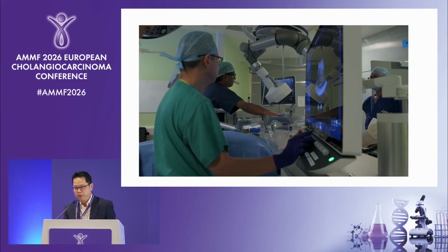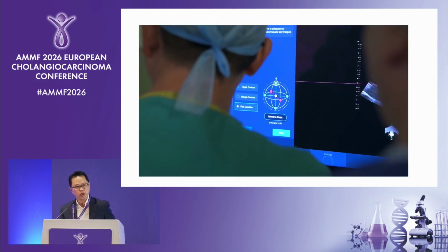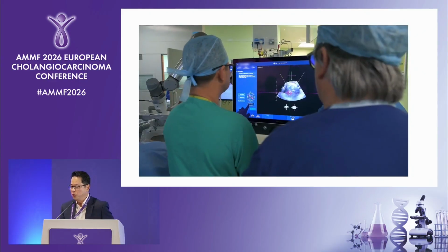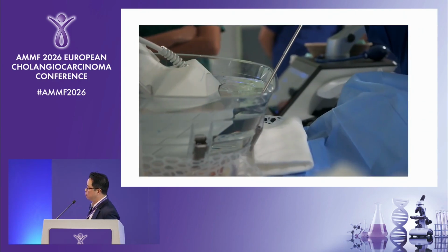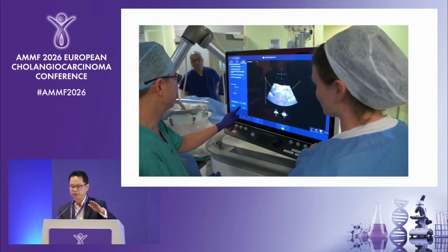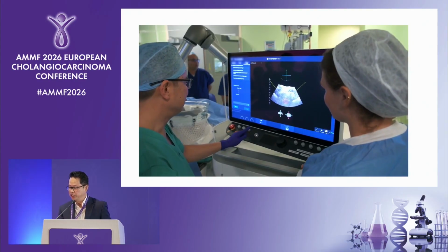So you continue. The important point here is targeting, that you are able to target the tumor accordingly. The most difficult part of the procedure is actually localization, or targeting the area precisely that you want to do. So we will have to spend a little bit of time, and once you're happy with that, then you contour the system, like identify the areas that you want to control. And therefore, the patient needs to be asleep, because if they move with respiratory excursion, then whatever you contour here may be misplaced, and you will not be able to deliver the energy accordingly.